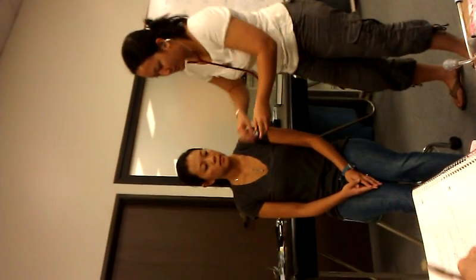And then you start using the ladder pattern. And when you're doing this, make sure you also listen throughout the whole breath, like inhalation and exhalation. Wait for it to finish before moving your stethoscope. Okay? So the first spot would be above the clavicle.